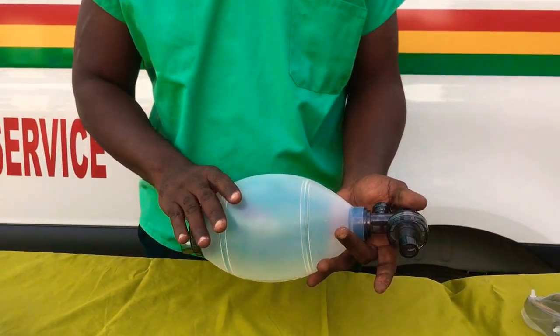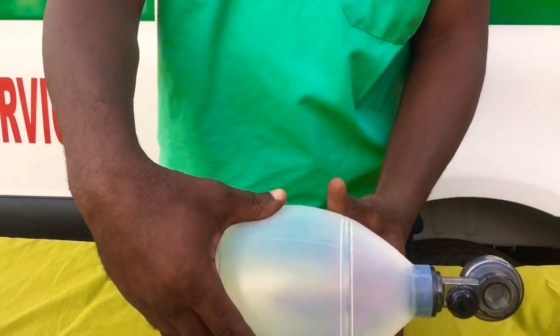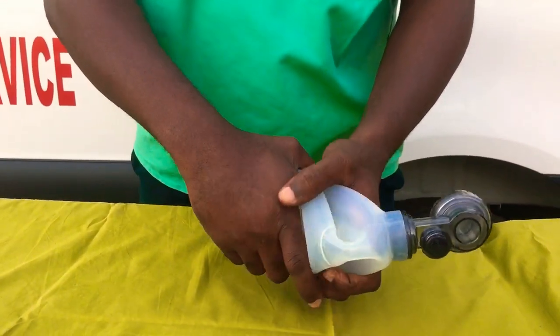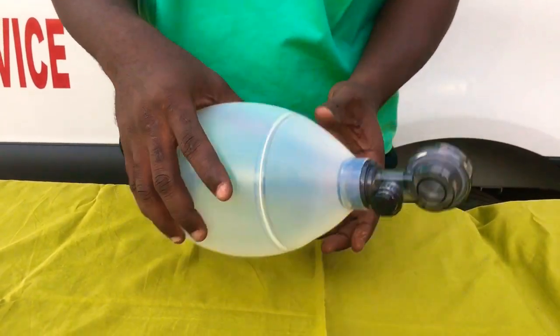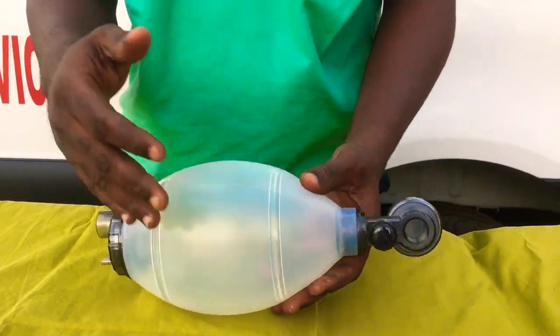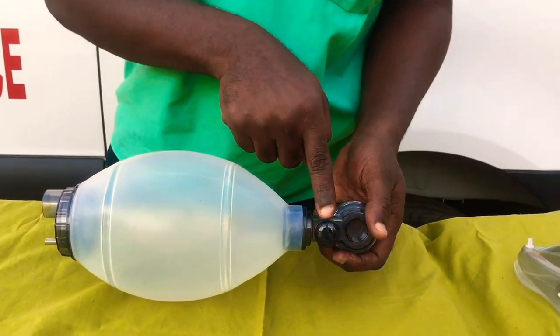Now we need to check whether it's functioning. First, you deflate the self-inflating bag and then you release it. If it doesn't self-inflate, then there is something wrong with the AMBU bag. So you press it this way and then you release — it self-inflates. The next thing to check is to make sure you watch whether this valve will be working.